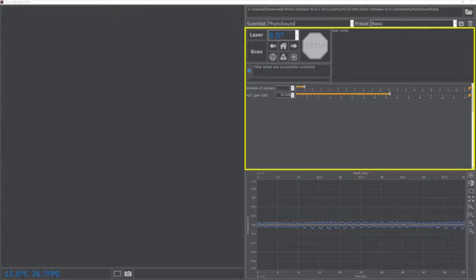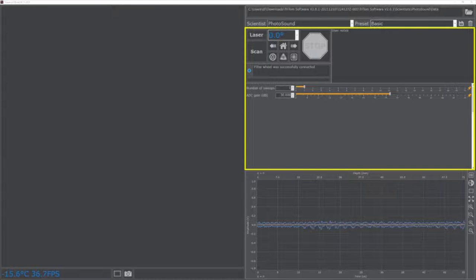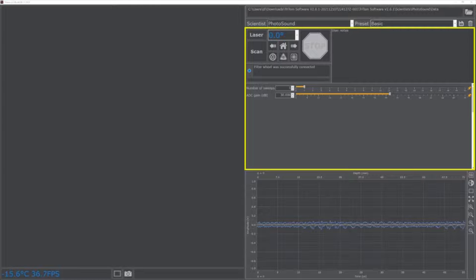The active settings menu will populate with the available settings for the laser, scan settings, camera settings, or photoacoustic signal viewer. Individual settings can also be pinned to the active settings menu by the user for quick access to the most used settings.